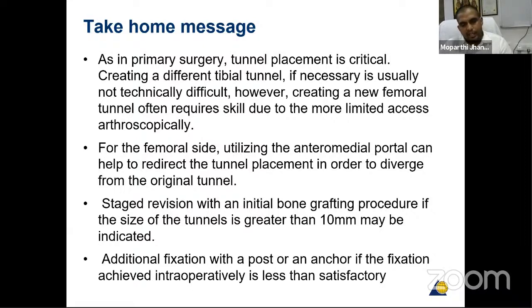Next is, as I told you, the graft size and bone grafting. It varies from surgeon to surgeon. But we should see when to go for the bone graft. Here they say 10 mm; with more than 10 mm, we can go for it. But some literature says 12 mm, some say 14 mm. But we should analyze that proximal to distal. If the tunnel is parallel, with no ballooning of the tunnel in between, we can use additional fixation like a post or anchor, according to the surgeon's choice.